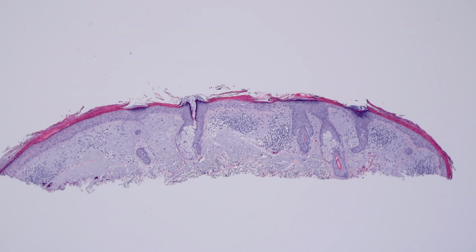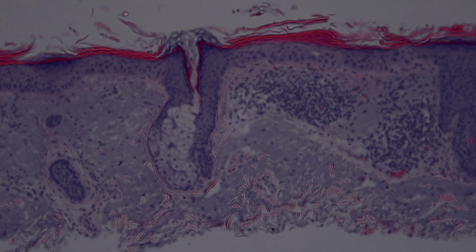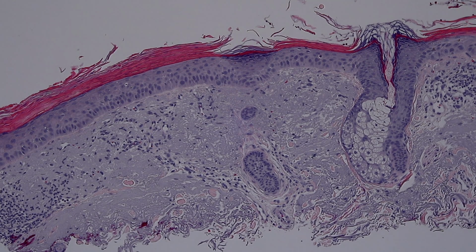So this is an actinic keratosis. These are due to ultraviolet radiation damage, usually not just occasional exposure, but years and years of exposure. Basal cell carcinomas can grow from intermittent high-intensity sun exposure, but usually actinic keratoses are in people with a significant amount of chronic sun damage. You can see that's the case here. Look at the dermis. The dermis is totally blue because it's all replaced with solar elastosis. And that is not just from occasional trips to the beach. That's working out in the sun day in and day out every day for decades that gives you that, okay?